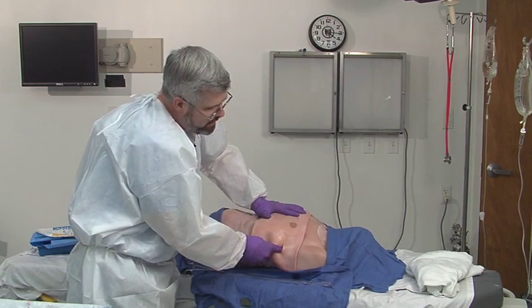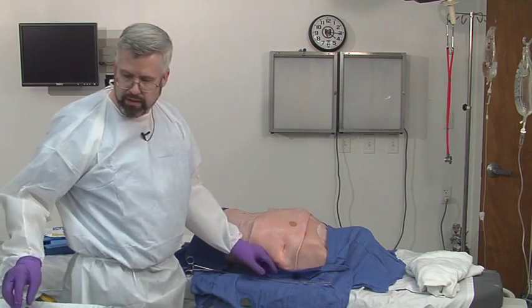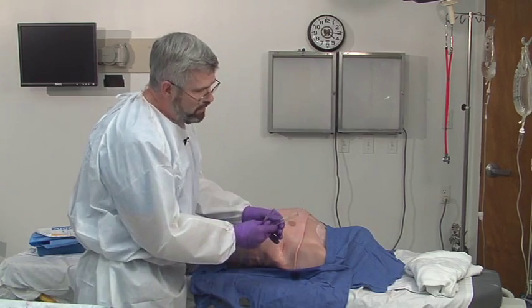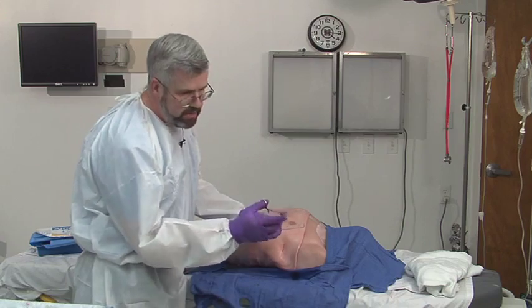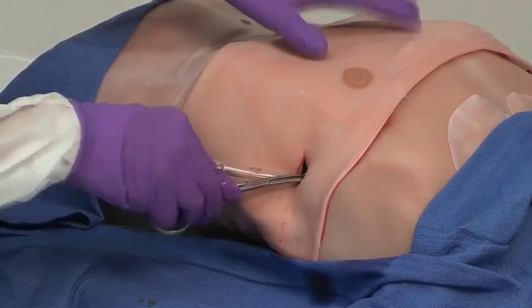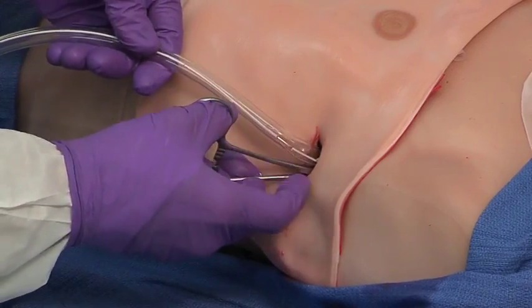And now the next step is to actually insert the chest tube. There's a couple of different ways of doing that. You can actually try to put the tube in directly, but I think many people find it convenient to take your clamp, put it on the end of the chest tube, and then try to follow this track right back into the chest the same way you went before. You can see I'm going into the chest.